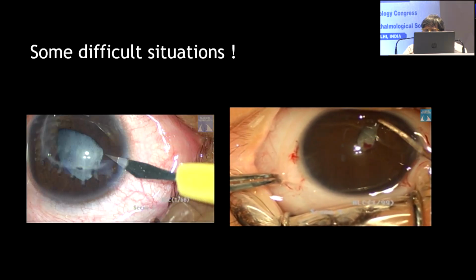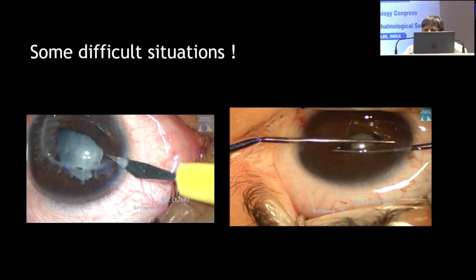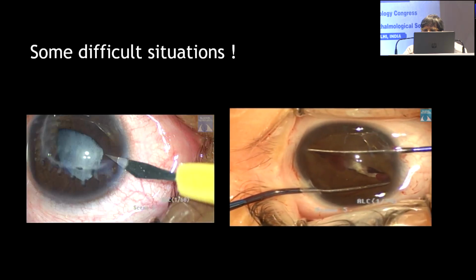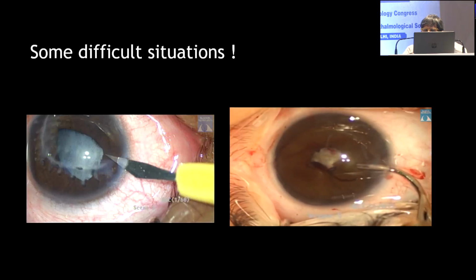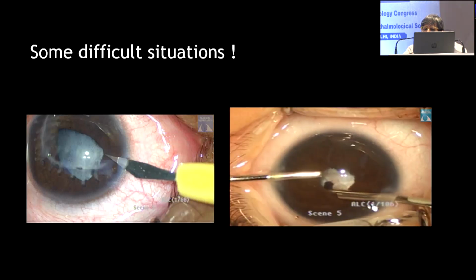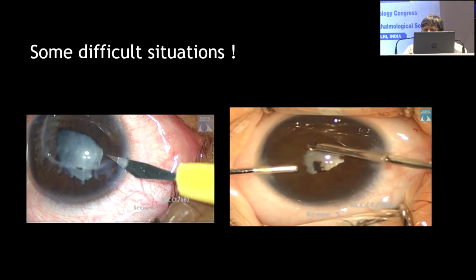on table, so you may have to use a 23 gauge cautery. Despite stretching using hooks, I am not able to get a good dilatation, and if you leave the membrane or take a half-hearted approach, then you're likely to see it develop again. The membrane will grow again and you will not serve the purpose of surgery.